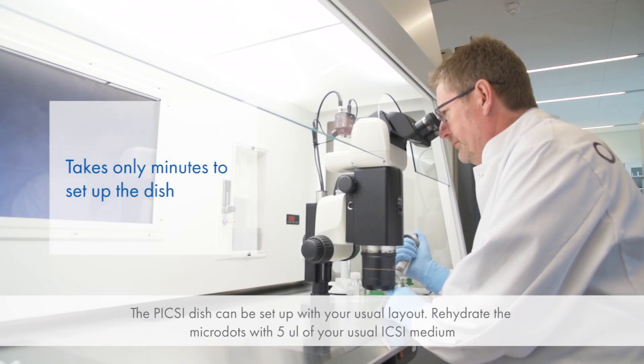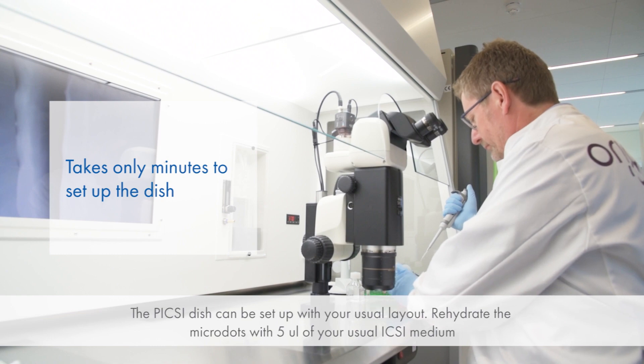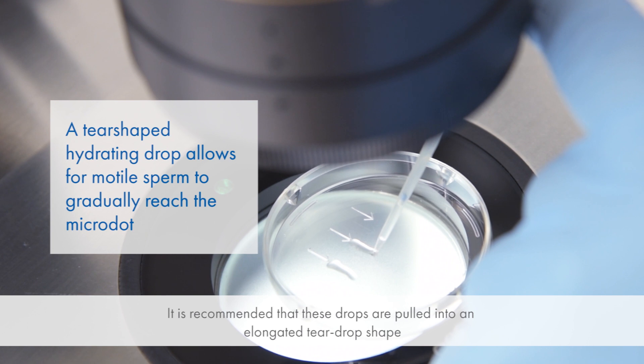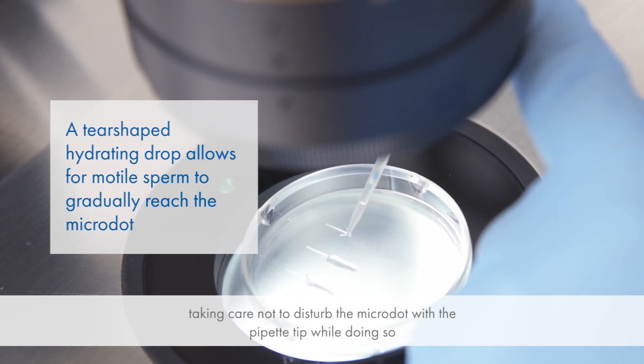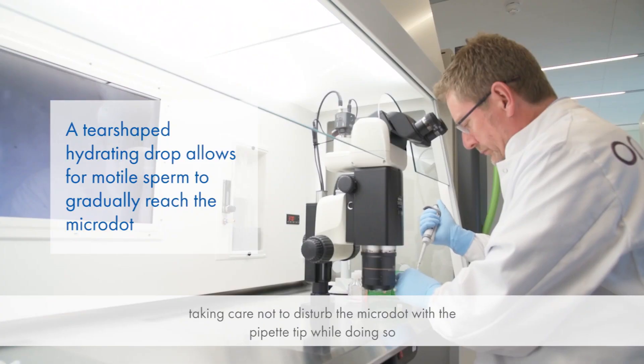The Pixie dish can be set up with your usual layout. Rehydrate the micro dots with 5 microliters of your usual ICSI medium. It is recommended that these drops are pulled into an elongated tear drop shape, taking care not to disturb the micro dot with a pipette tip while doing so.